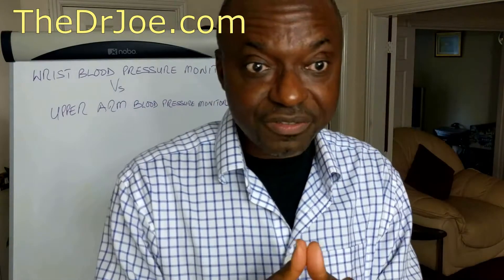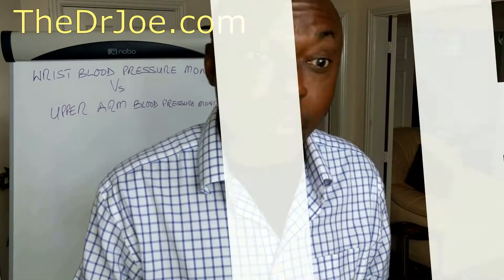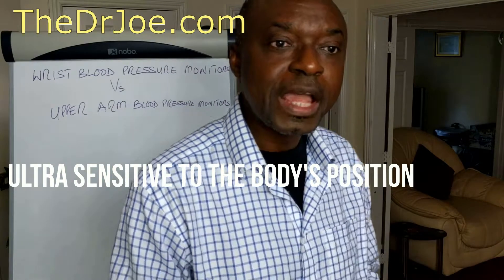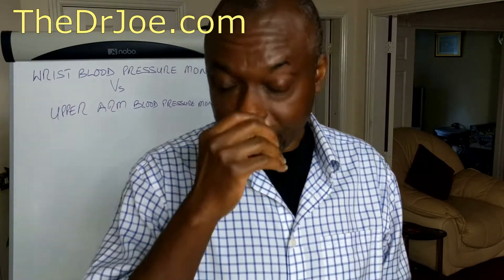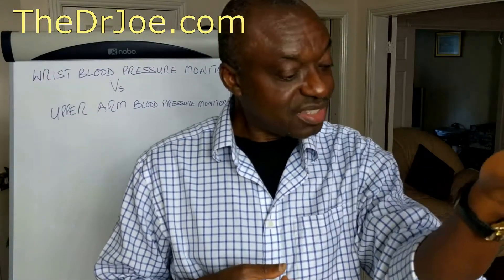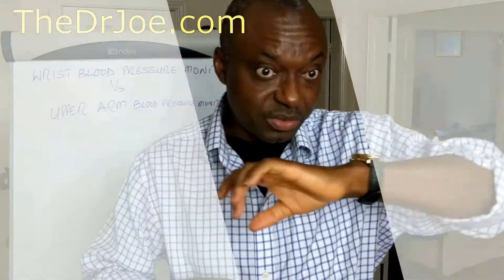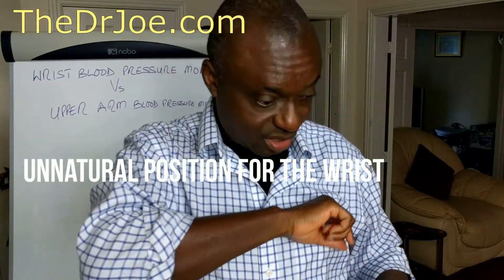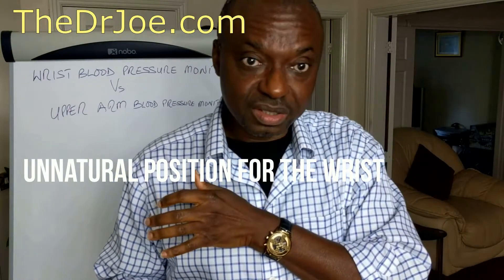So why do the wrist monitors give unreliable readings? Well, for a start, wrist blood pressure monitors are ultra sensitive to the body's position compared to the upper arm monitors. The second reason is that when you're trying to measure your blood pressure, the cuffed part of the body — whether it's the wrist or the arm — should be at the level of the heart. And as you can tell, this is not a very natural position for the wrist.